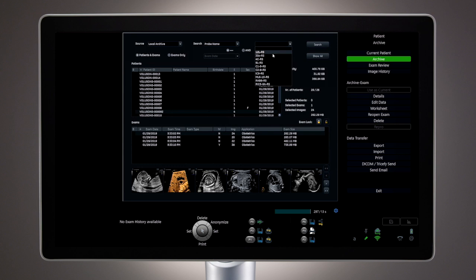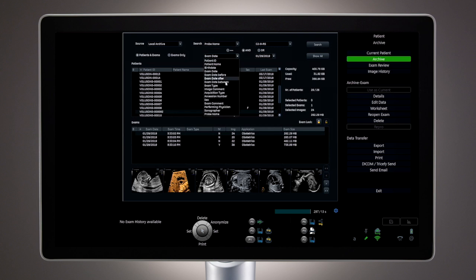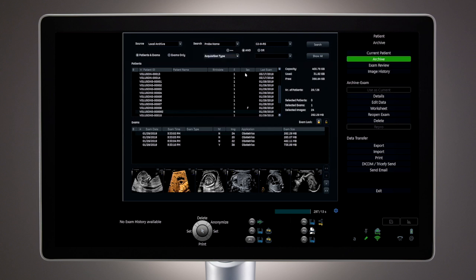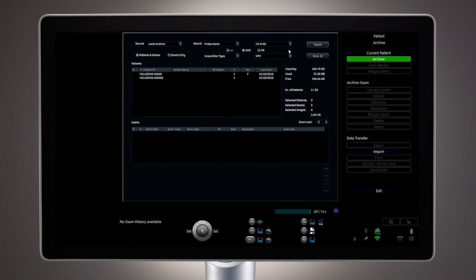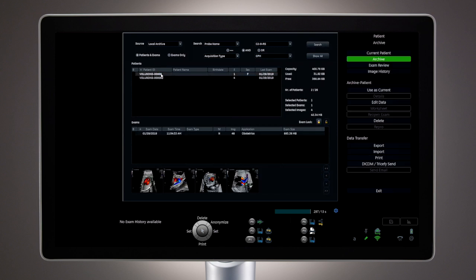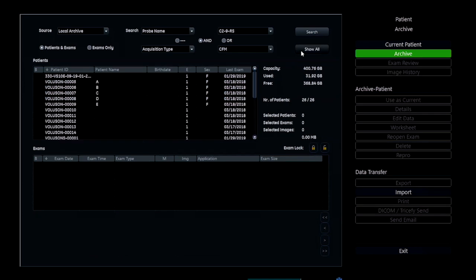The patient archive can be searched using many different filters, as well as a combination of search items to help narrow down the results. Once the criteria are chosen, select Search and images matching the search criteria will be displayed. Select Show All to remove the search filters.